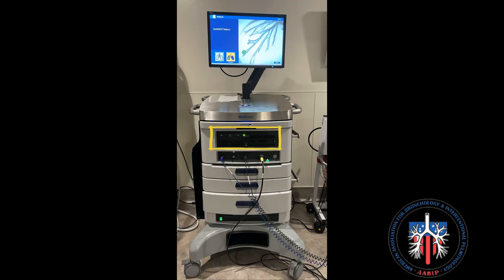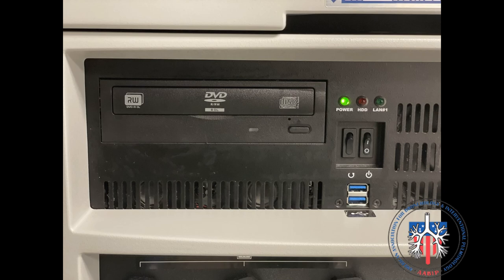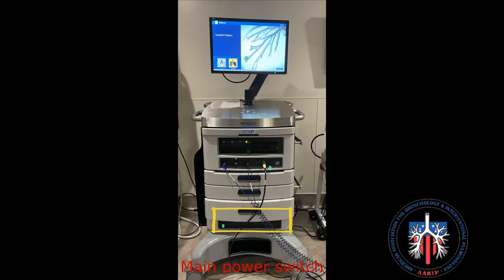Next is the anatomy of the Lumisight tower. The CD-ROM drive is where burned DICOM CT images or already planned procedures can be uploaded. DICOM images or plans can also be uploaded by USB drive. The power indicator light is turned on; however, do not turn the system on or off at this switch. Instead, turn the system on or off at the main switch as shown.